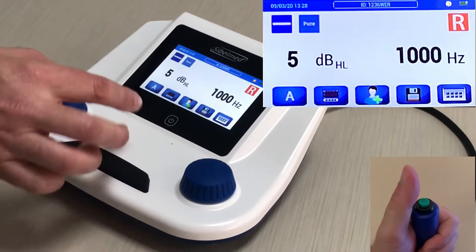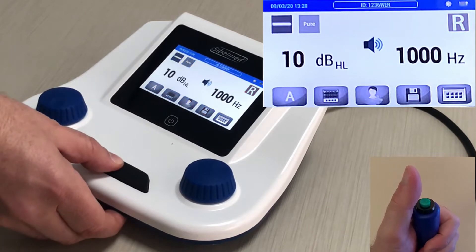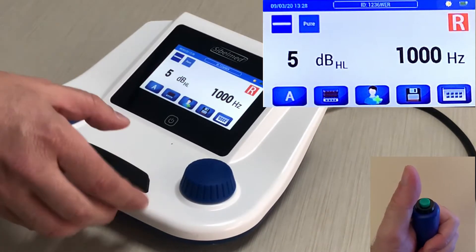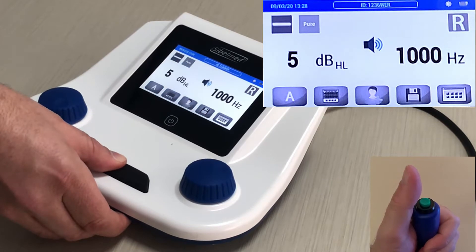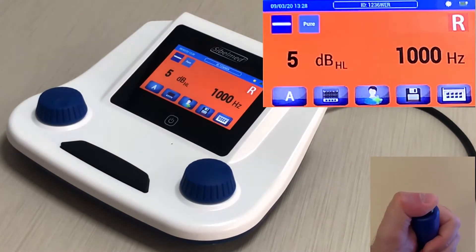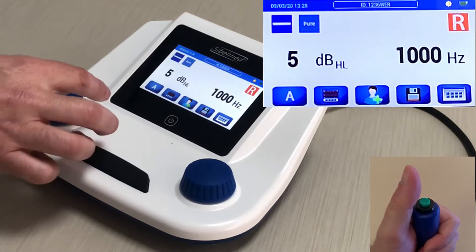We increase the tone step-by-step until we find the first level heard by the patient — this will be the threshold that we need to save. If the patient presses the button without any signal being sent, then the screen will light up in red.